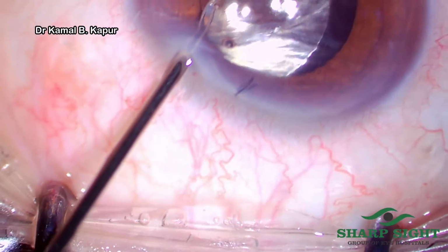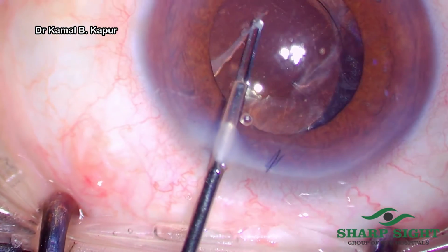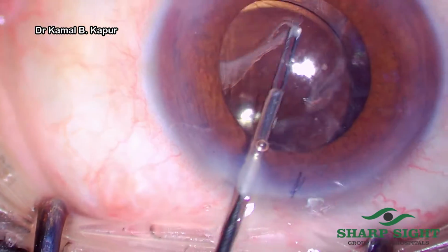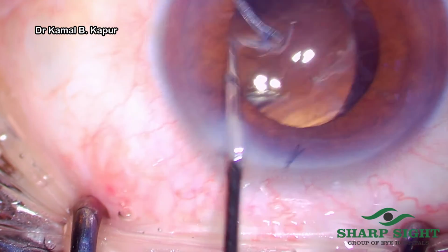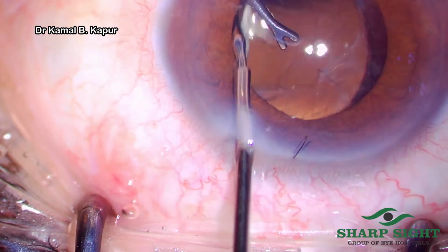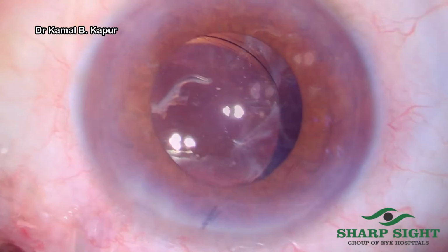So we try and do a peeling movement, and yes, we are successful in breaking that fibrotic band which is going underneath the iris and hidden. We go in with a micro forceps and trim that capsular tag. The fibrotic capsular tag is then removed using a micro forceps.